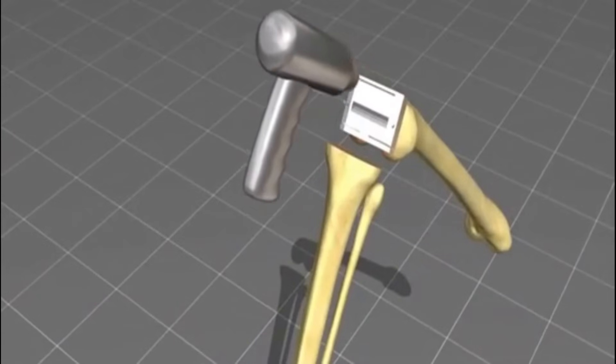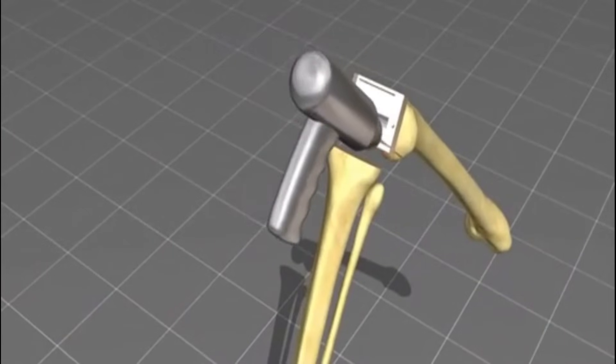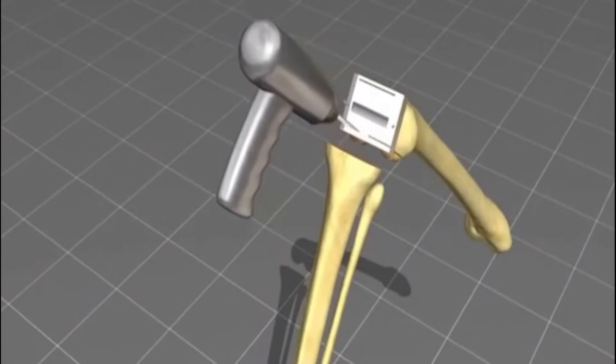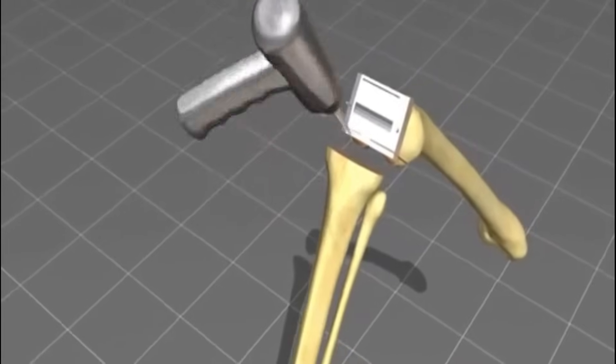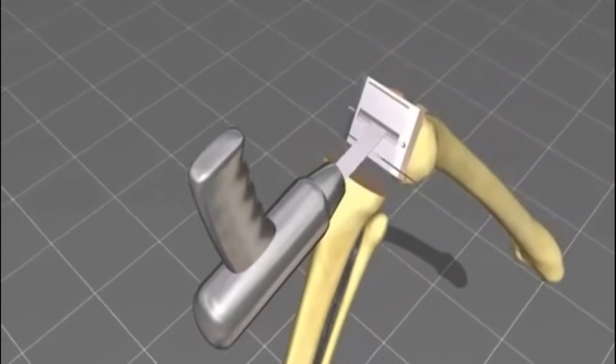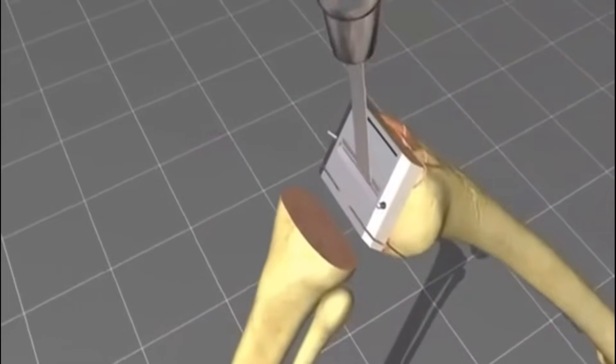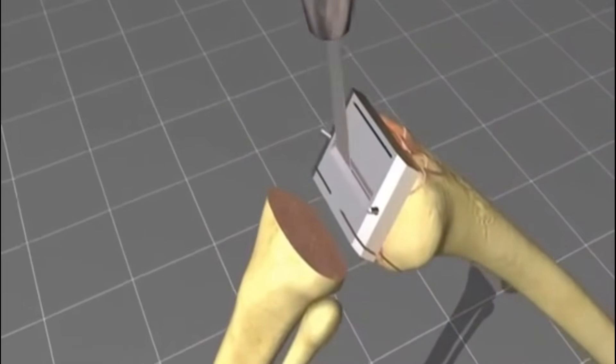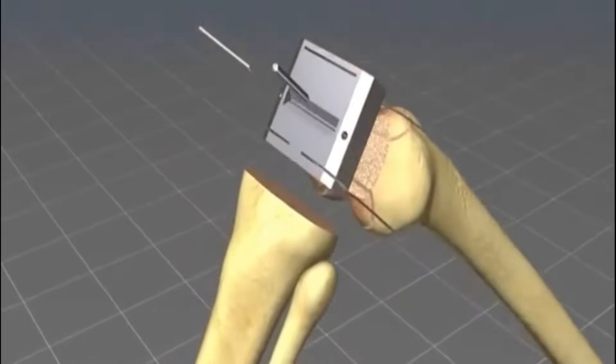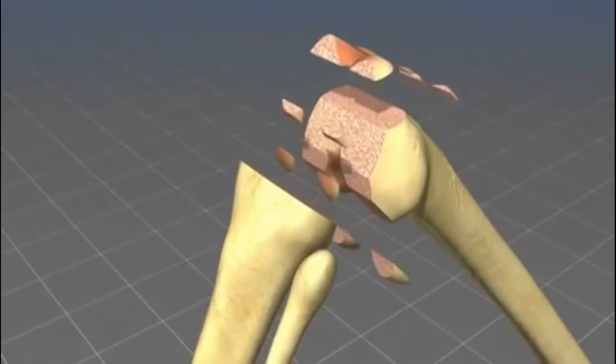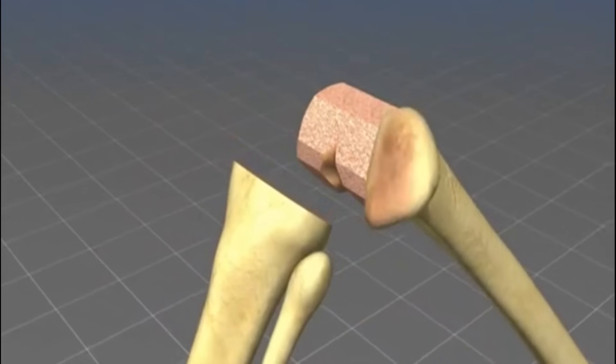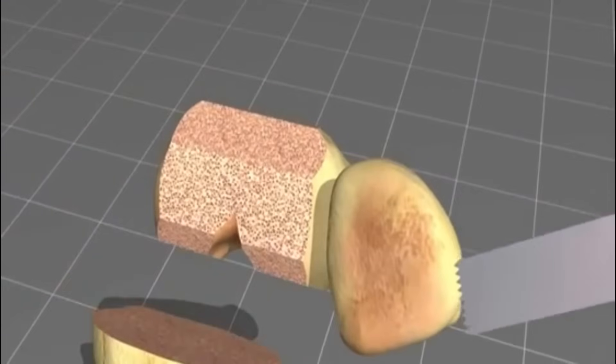The next saw block is used to remove the anterior and posterior part of the femoral condyles, as well as some minor diagonal cuts are performed. After removal of these bone parts, the femoral side is ready to take the prosthetic device.